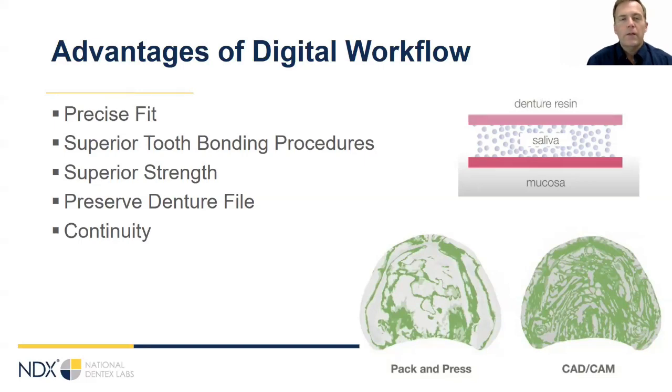One other interesting thing about digital dentures is that when you set the path of insertion, the technician can really work hard to minimize the undercut and do the absolute least amount of block out that's necessary. So it's an area where your technician's skill can really push up against the edge of what's possible more than with an analog blockout process, I would say.